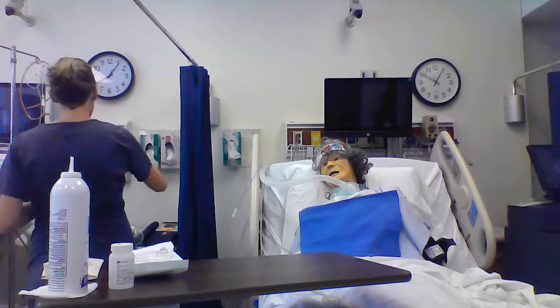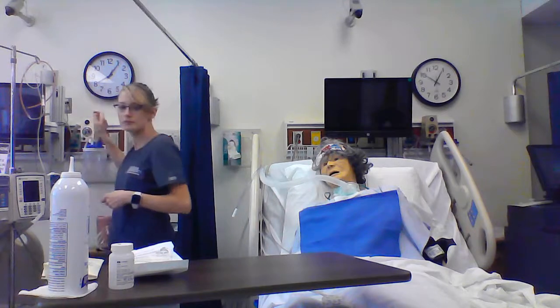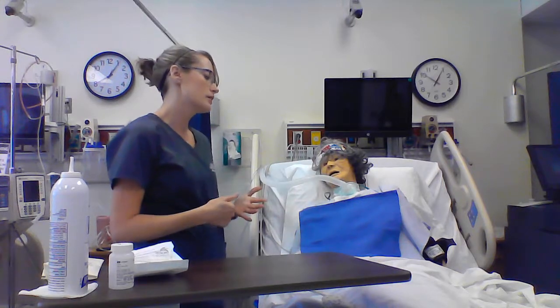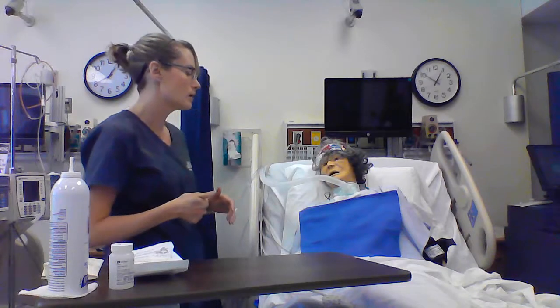I want to hyperoxygenate her, so I'm going to turn her oxygen up. I'm going to turn my suction on between 80 and 120. I want to stay on the low end of that unless her secretions are extremely thick or difficult to get out, and then I can turn it up a little higher if needed.